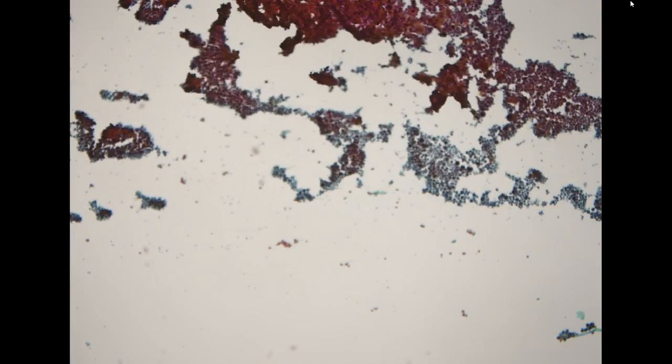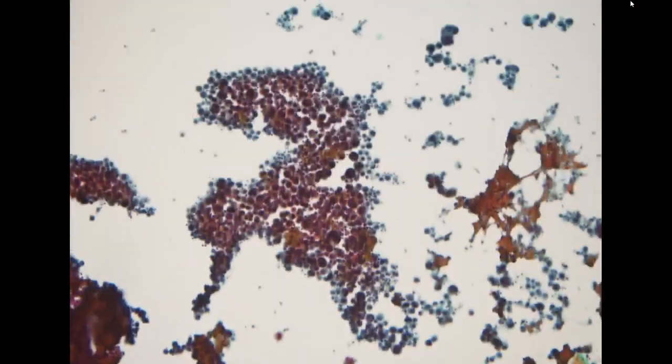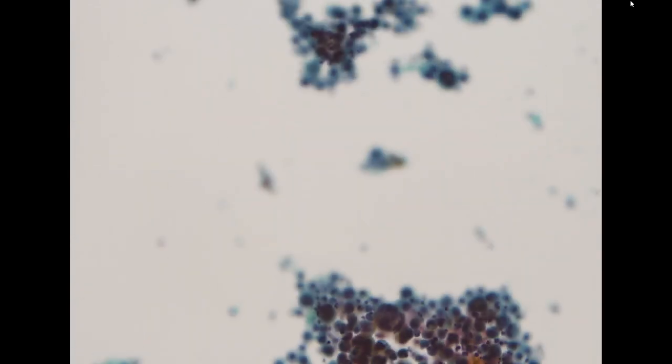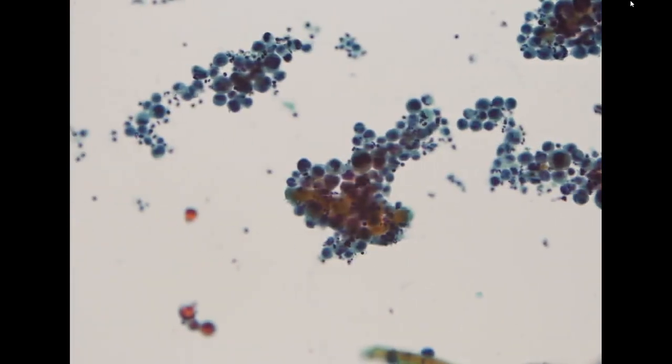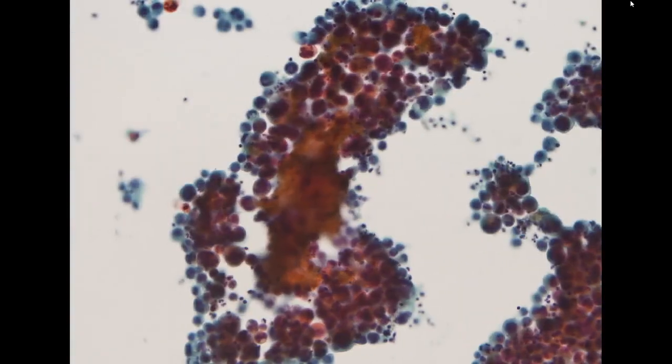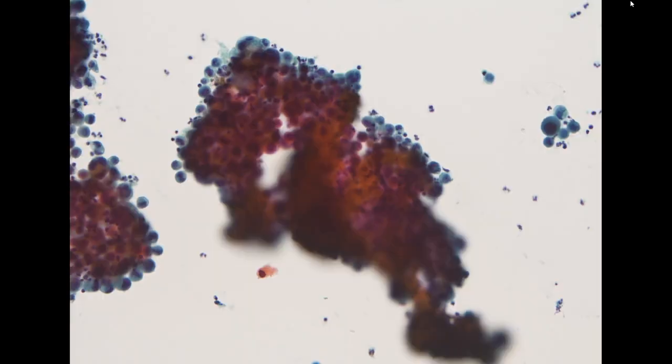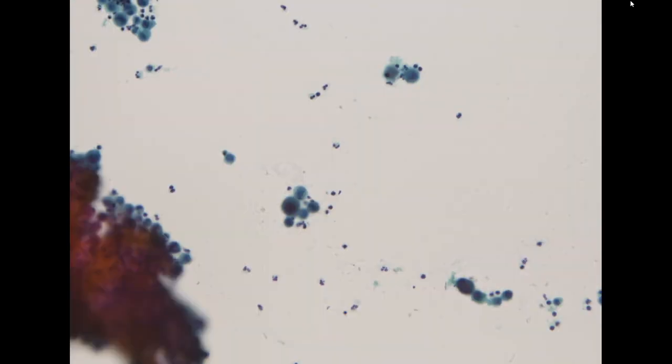The next specimen is a pleural effusion specimen. The patient actually had ovarian cancer. So she is not a patient with lung cancer. In this specimen, we see poorly differentiated high-grade cells, mostly in single cells, some with loose cohesion. So these have already gone beyond the diaphragm to the pleural cavity. This is compatible with involvement by ovarian cancer with poor differentiation.